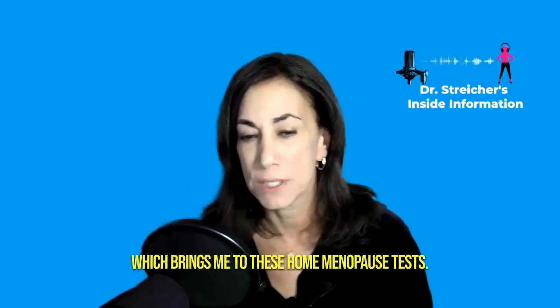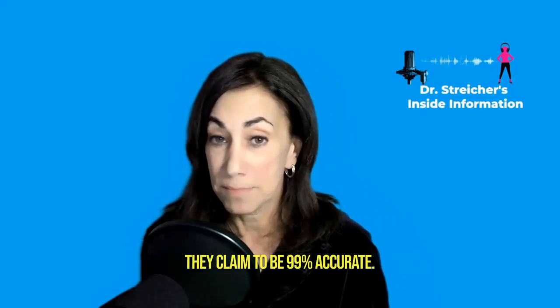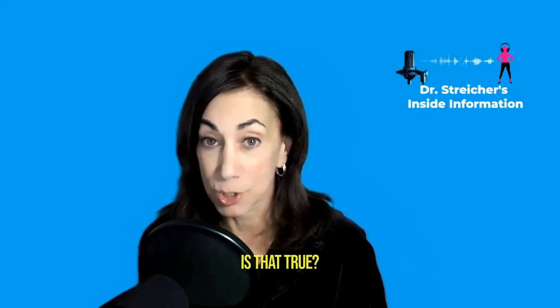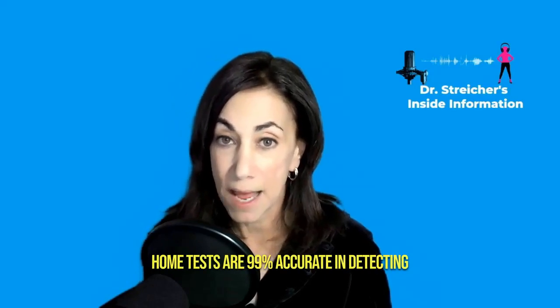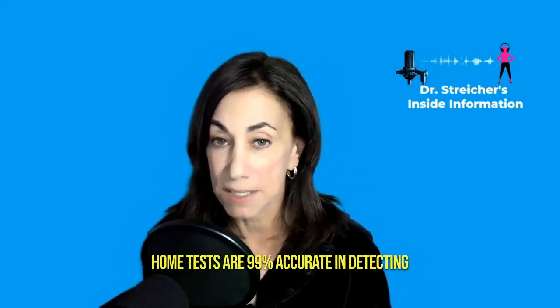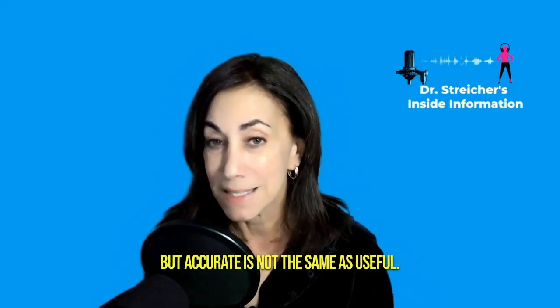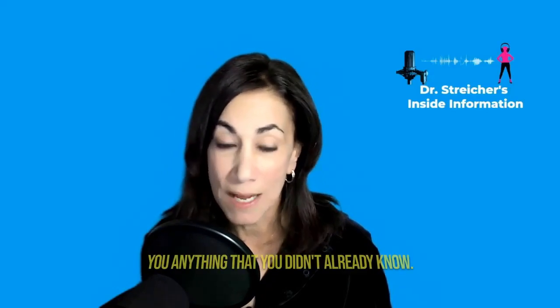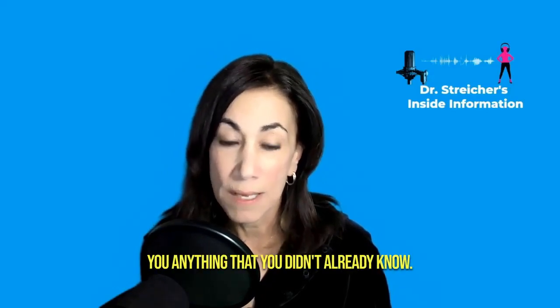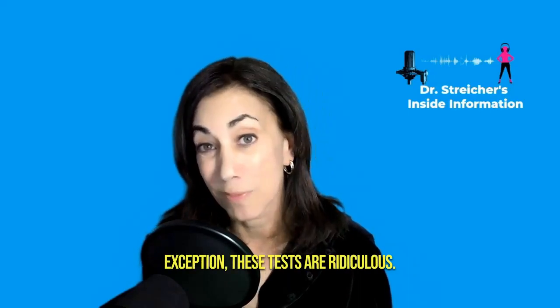Which brings me to these home menopause tests. Are they accurate? They claim to be 99% accurate. Is that true? Well, it is true. Home tests are 99% accurate in detecting the presence of FSH in urine. But accurate is not the same as useful. Accurate does not mean it will tell you anything that you didn't already know. In my opinion, with rare exception, these tests are ridiculous.